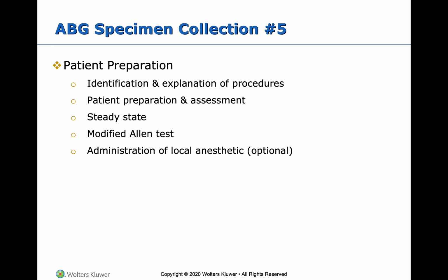Okay, so in preparing your patient for your arterial blood gas specimen, I've heard some respiratory therapists explain the procedure. I'm going to show you a video about an ABG collection that I think explains the procedure pretty well too. But you want to make sure that your patient is prepared for it.